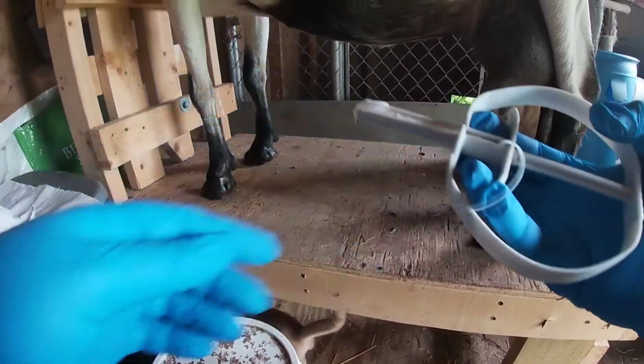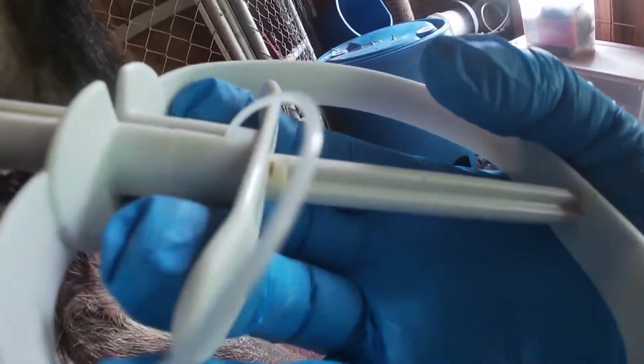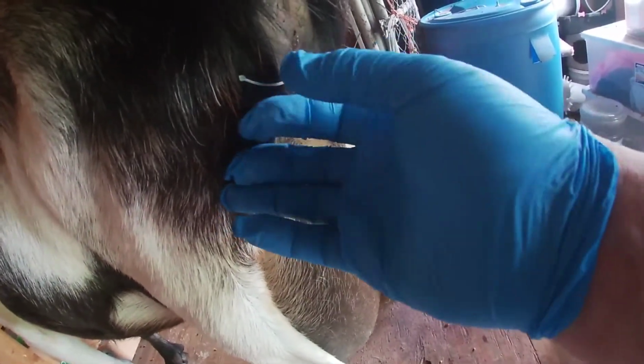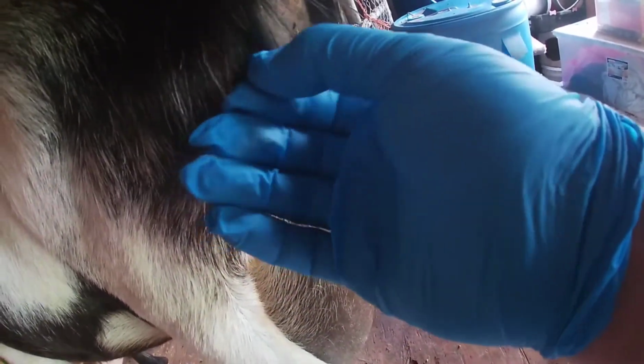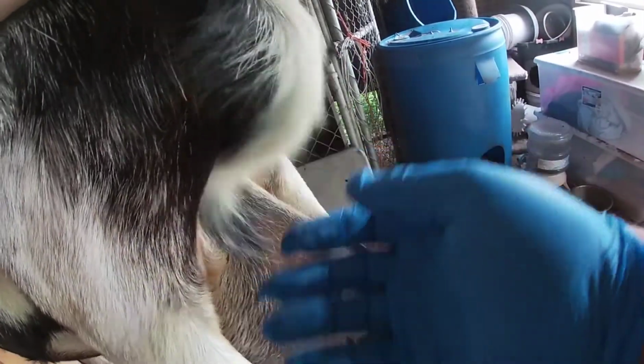But here we go. Insert the next one. Hold the tail. They don't like this part very much. Insert upward. And that's all there is to that. So now you'll see this little tail. You should see that all the time, but sometimes they can suck that up, so don't worry about it. It does have a little knob on the end of it, so whenever you do pull it out, you have a little bit of leverage to pull it.